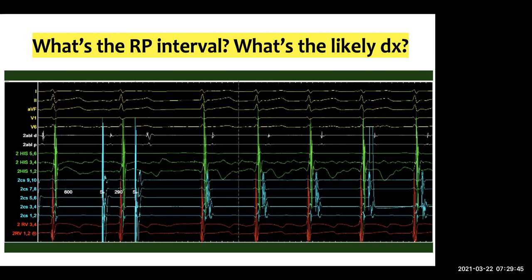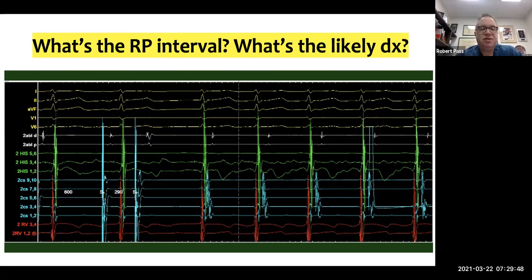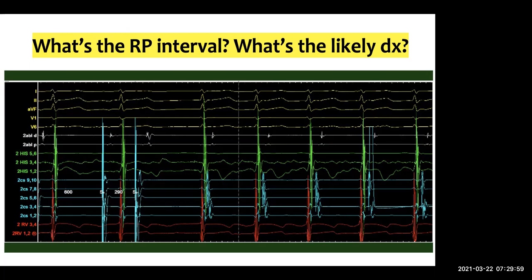Now, at the time that I put this together, Dr. Mohan promised more tracings from this case each day. So if you're interested, you can go look on Twitter for Sean Mohan and see the rest of the case. Okay, thank you, Dr. Mohan, for this interesting tracing.